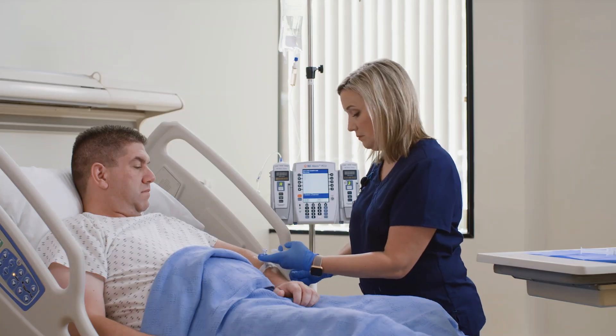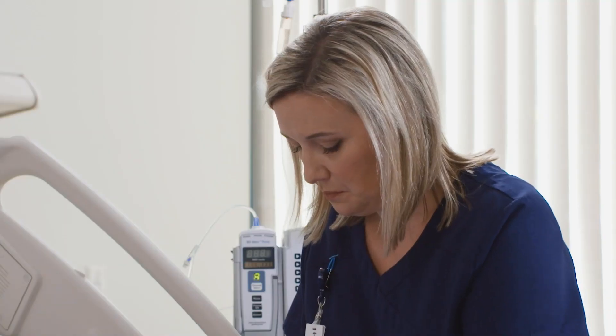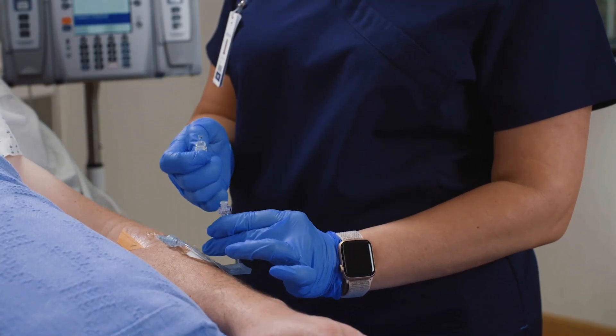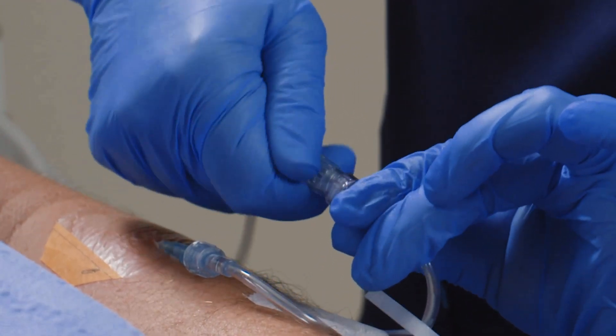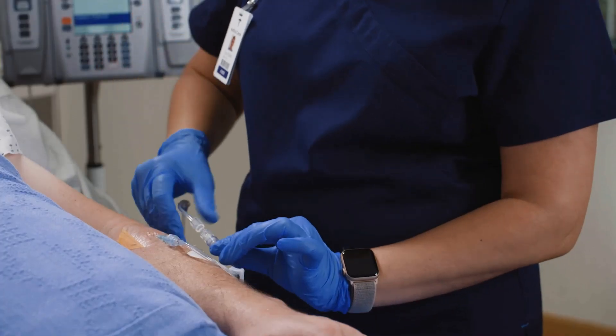Before attaching the Q-Site to the catheter, remove the protective end cap. Keep in mind that some extension sets feature a two-piece spin collar. For those sets, pull back the collar, insert the male lure, and give it a one-quarter turn before tightening the spin collar. Ensure a secure connection is made. Do not over-tighten.